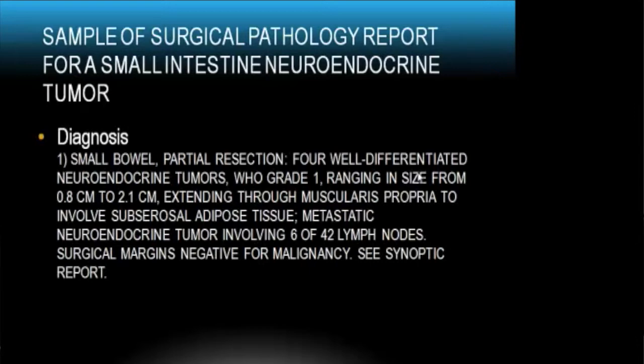So finally, I just want to give a sample of a surgical pathology report, using a small intestine neuroendocrine tumor as an example. We usually have 2 portions in our diagnosis: a top line followed by a synoptic report. In the top line, we give you the specimen we received, what type of procedure was done, and the diagnosis, and sometimes we see multiple tumors, and tumor grade, tumor size, how deep the tumor invasion is, whether there are positive lymph nodes or not, and whether the tumor is entirely resected or not. So we give you all the essential information in the top line.